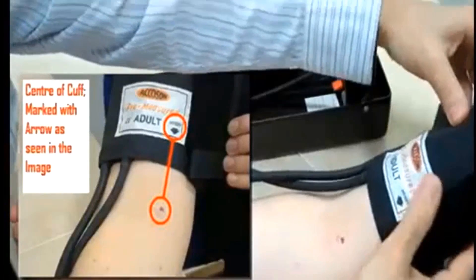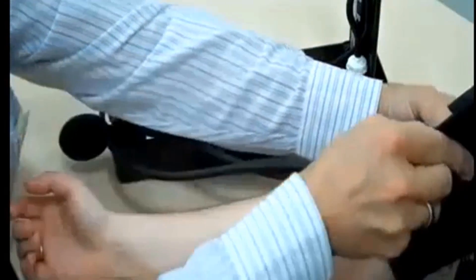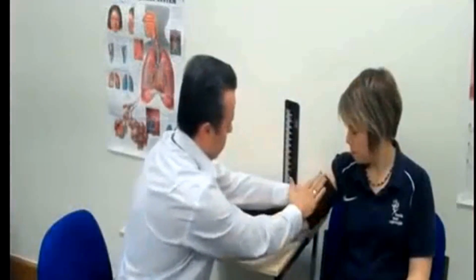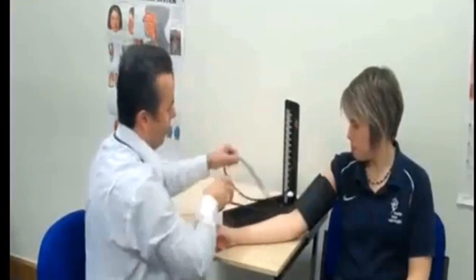You can measure the antecubital space — the area on the inside of the elbow. Then choose the proper cuff size. Wrap the cuff around the patient's arm and use the index line to determine if the patient's arm circumference falls within the range area. Otherwise, choose the appropriate smaller or larger cuff.